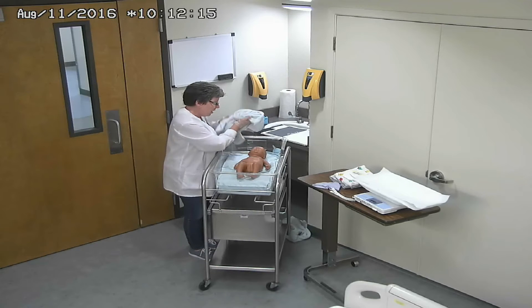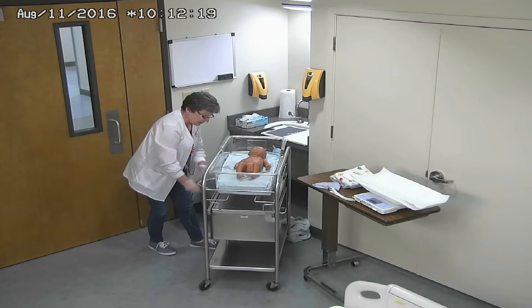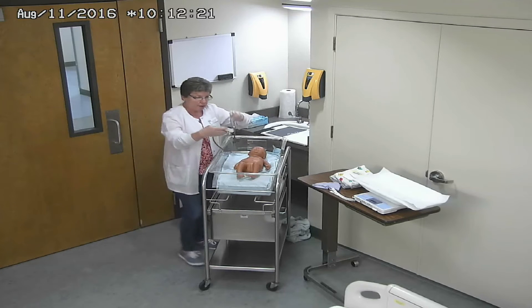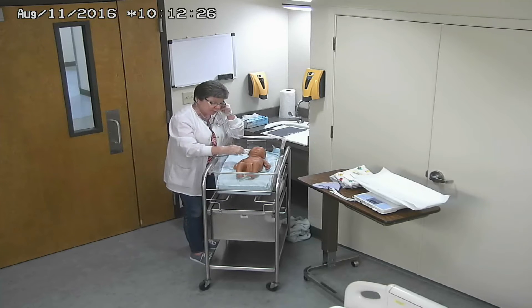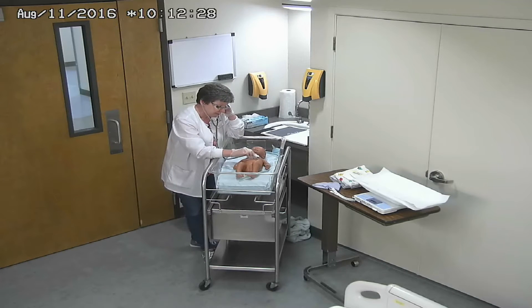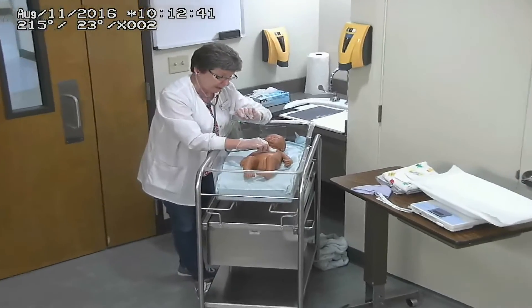As soon as I get most of the moisture off the child, I'm going to get my stethoscope and start listening to lung sounds. Of course, I want them to be clear, and I'm going to use a pediatric stethoscope specifically. Respirations are 40 to 60 per minute in a newborn, and that's considered normal. I am going to count for one full minute — that's very important.